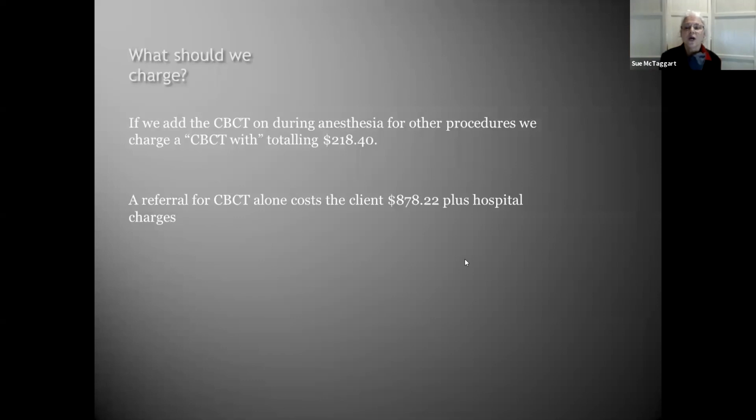Okay, so I really try hard, and I prefer to take a scan before I do anything to the face. And when we give them their sedative and we're getting ready to intubate, I like to do the scan before they're intubated so that I can see the occlusion. And that is really helpful.